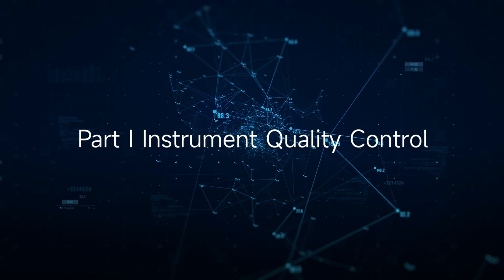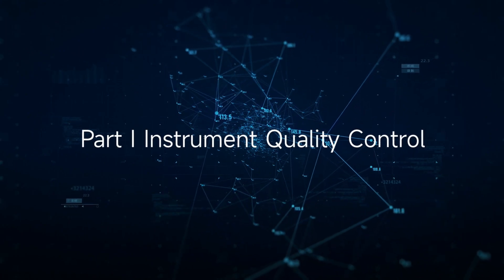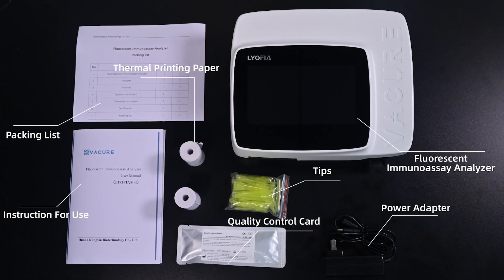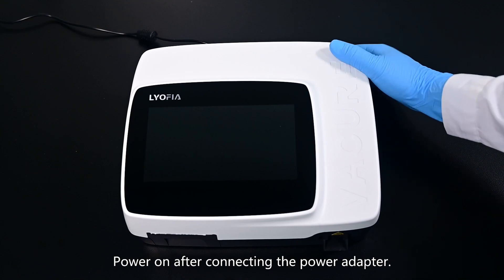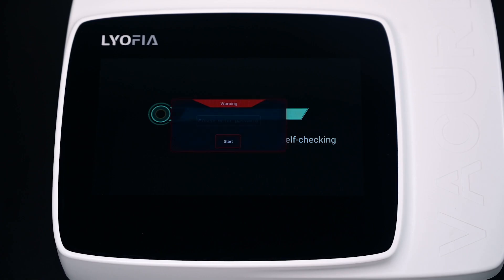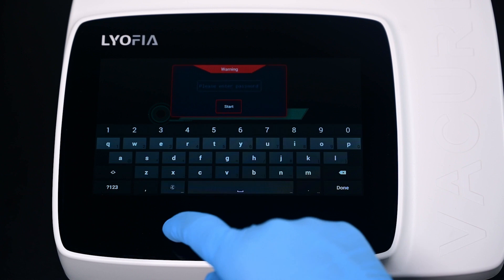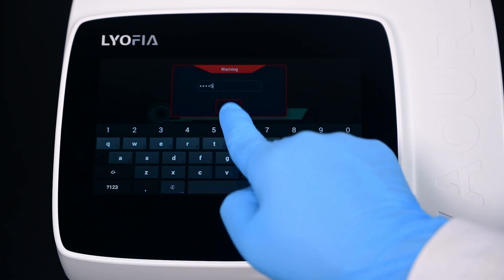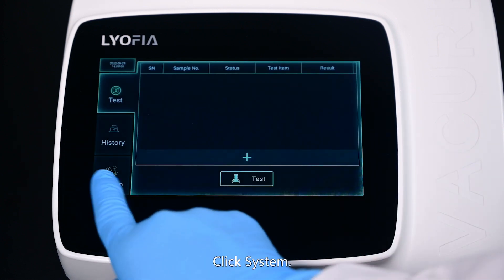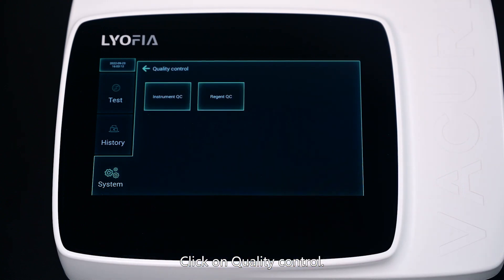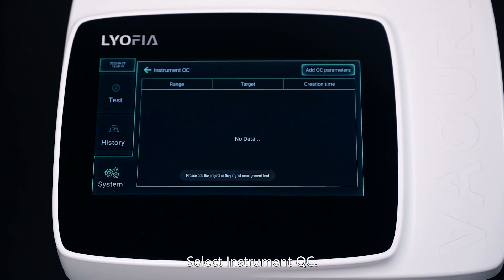Part 1: Instrument Quality Control. Power on after connecting the power adapter. Enter the password. Click System, click on Quality Control, select Instrument QC.